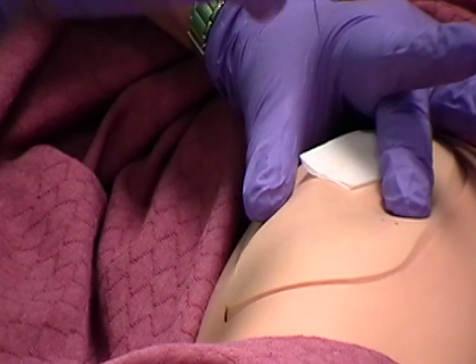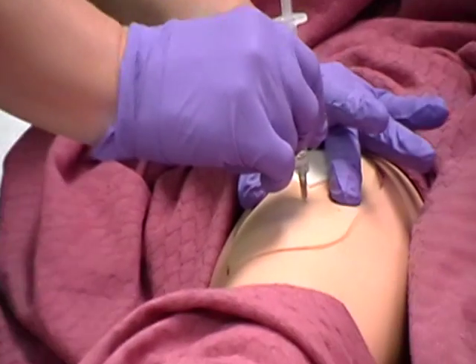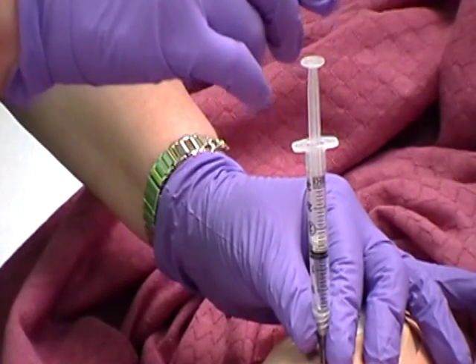Insert needle with a darting motion quickly at a 90-degree angle into muscle. After needle pierces skin, grasp lower end of syringe barrel with your non-dominant hand to stabilize the syringe.